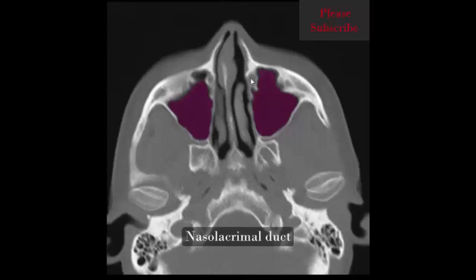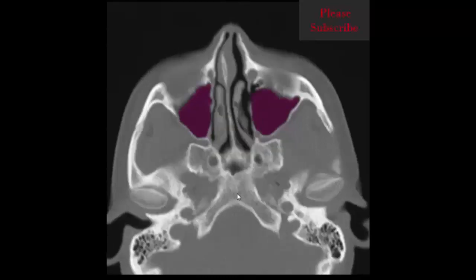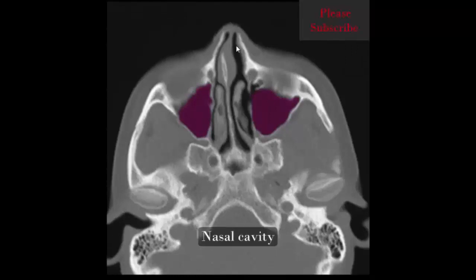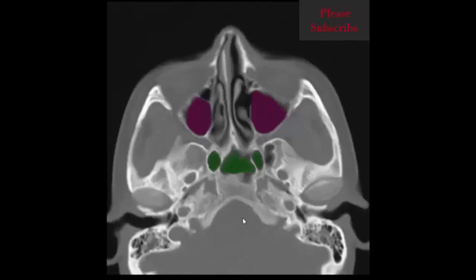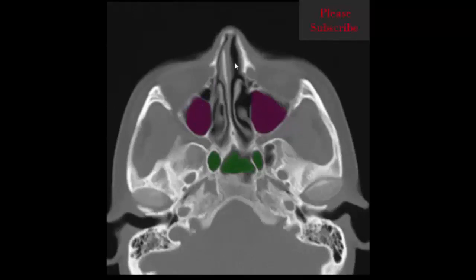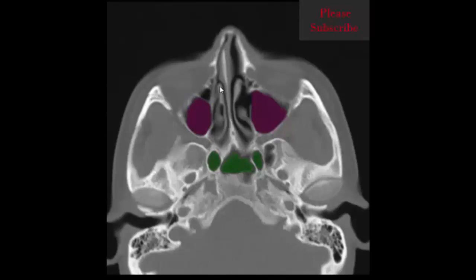Continuing upward, we identify the right and left maxillary sinus, nasal septum, nasal cavity, right and left maxillary sinus again, and right and left middle turbinate.